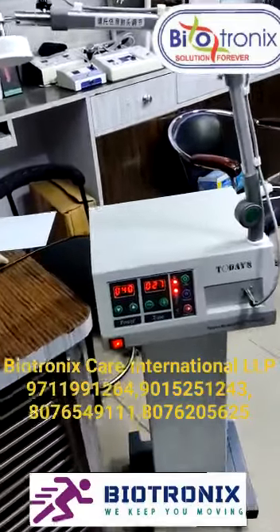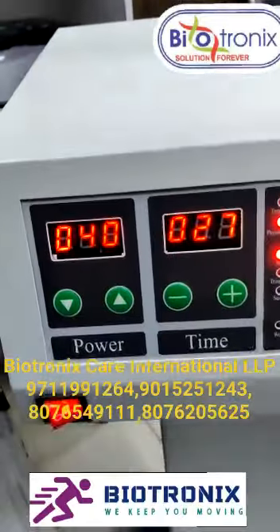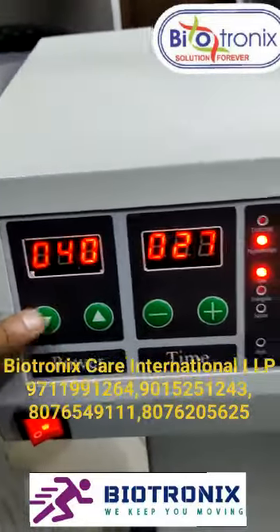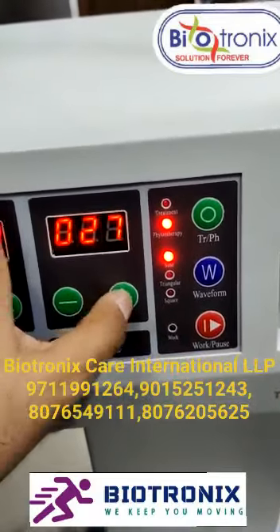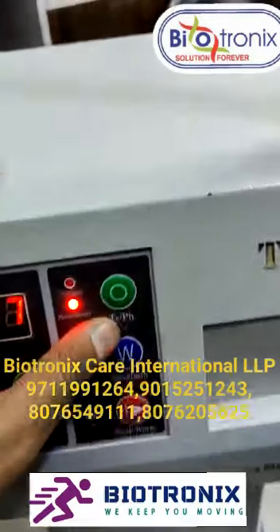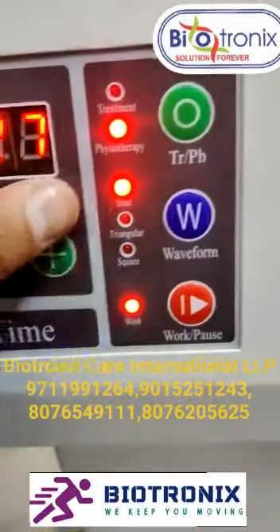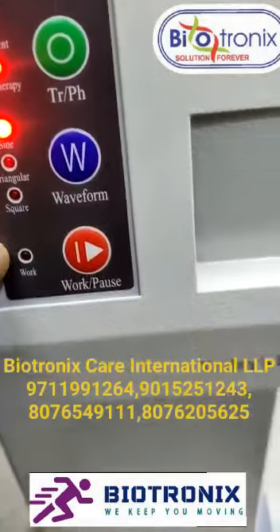This is microwave diathermy. Here we can set the power of the machine as per our requirement. This is for timing — we can set the time. For physiotherapy, we can select the physiotherapy mode. For the waveform, we can select sine wave, triangular, or square.